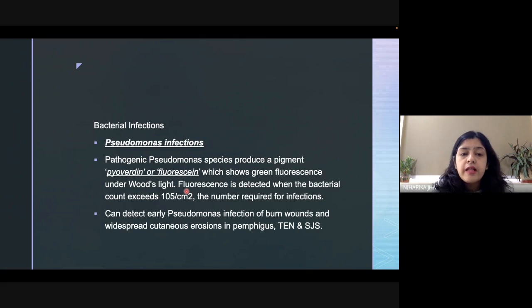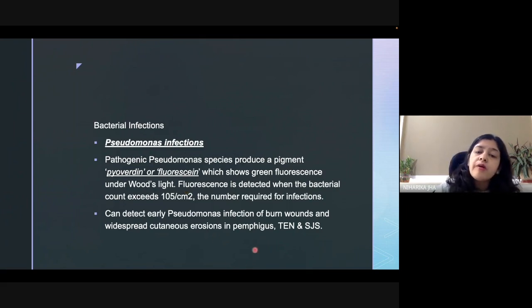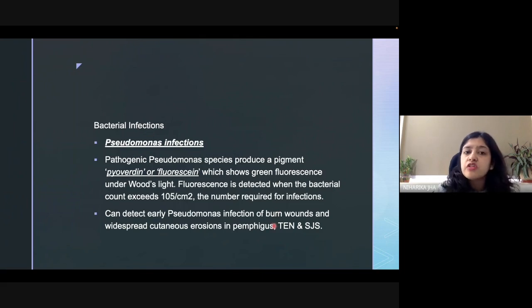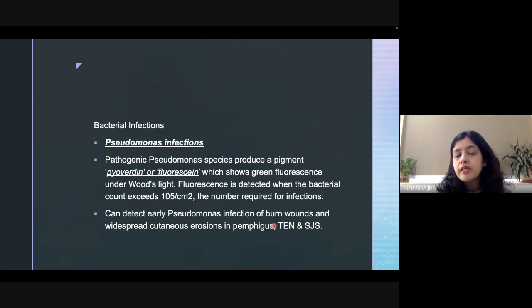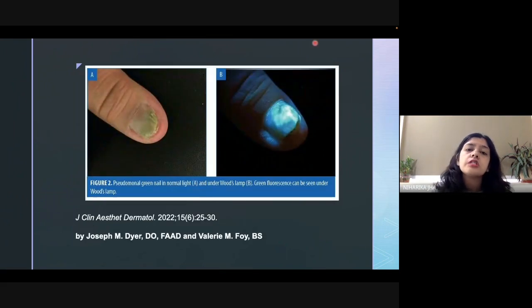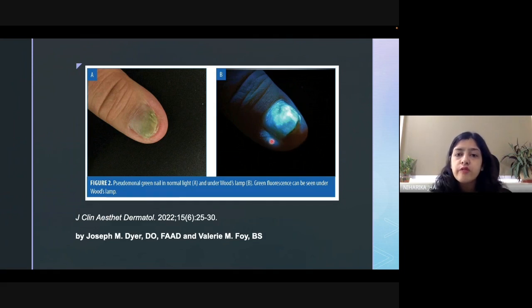This is helpful because we can detect pseudomonal infections early in critical cases such as Stevens-Johnson Syndrome, TEN, pemphigus, or burn patients — patients who have a high risk of pseudomonas infection. Culture reports might take a few days to come, but with the help of Wood's lamp we can make an early diagnosis and start the patient on antibiotics earlier. This is a patient who has pseudomonas green nail syndrome, and under Wood's lamp we can see a green colored fluorescence.